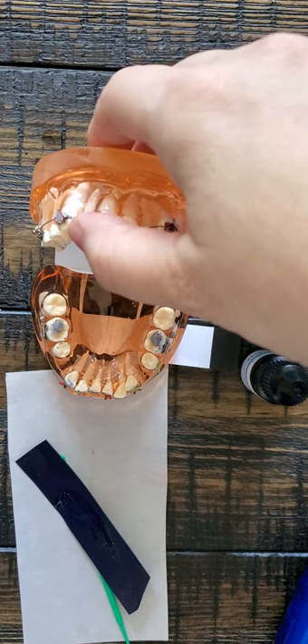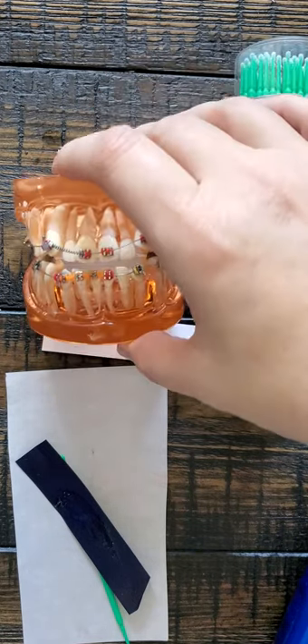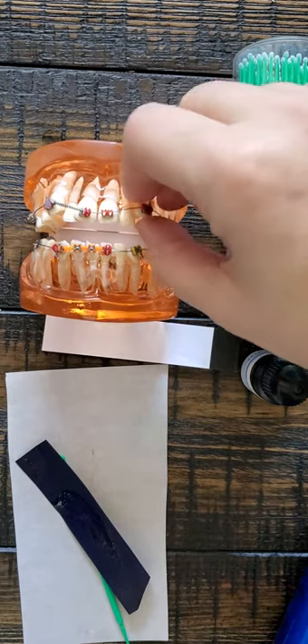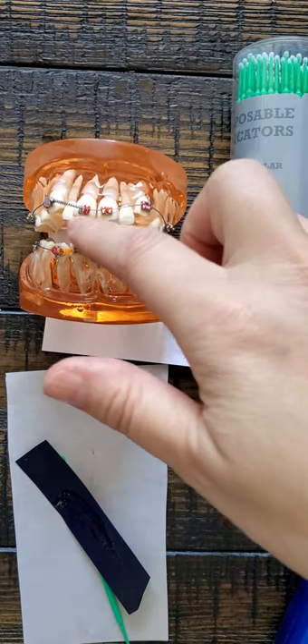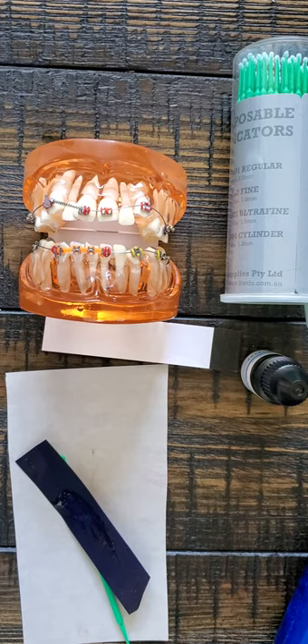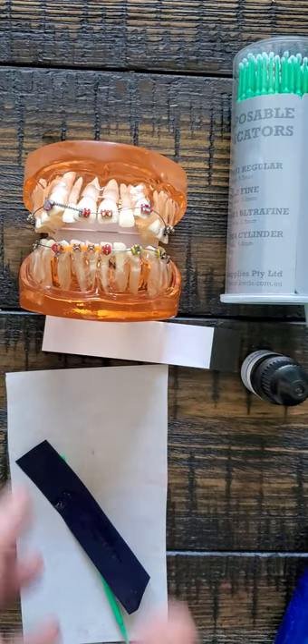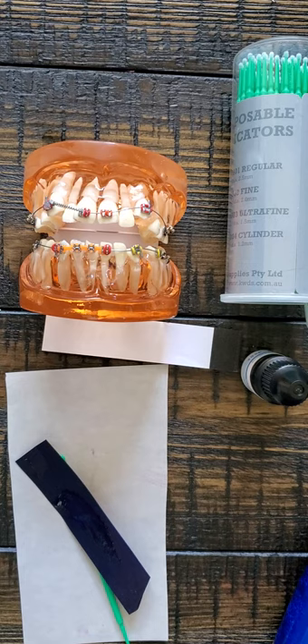You won't forget to take them off at the end, and you'll make sure you get it all off, which patients appreciate. That's the trick of bite turbos — posterior bite turbos. If you want to do anterior bite turbos, that's okay too — that's for something different. I tend to do anterior bite turbos either on the backs of the canines or the backs of the front teeth. You can actually buy a mold for those which makes them a really nice shape, or you can just do the style I just showed.